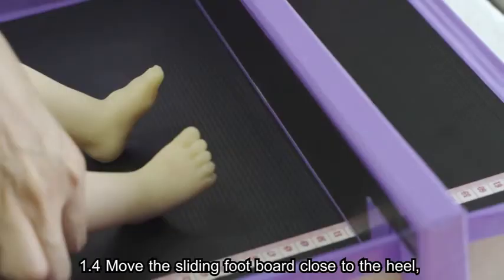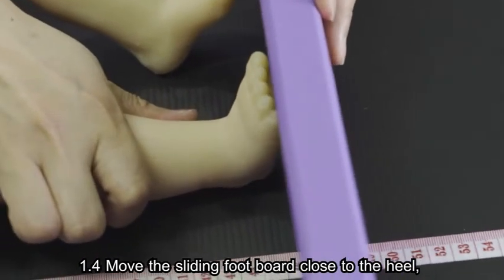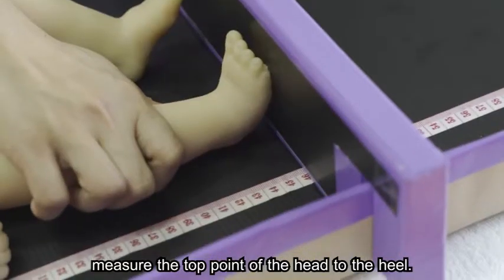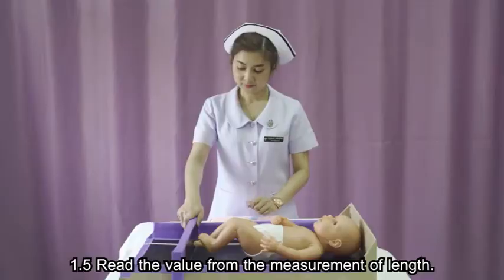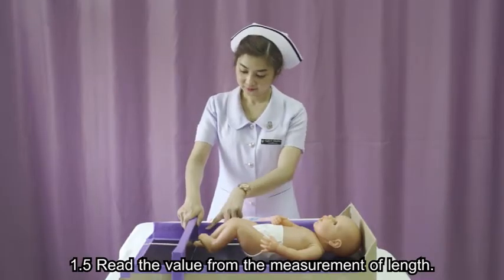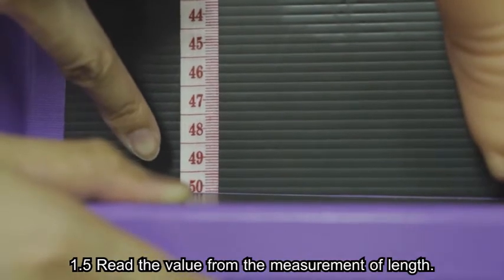1.3. Hold the baby straight with the baby's neck in a neutral position, holding the knees and feet straight. 1.4. Move the sliding footboard close to the heel. Measure the top point of the head to the heel. And 1.5. Read the values from the measurement of length.